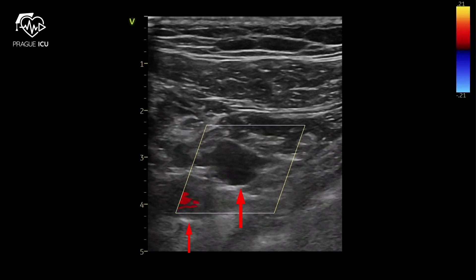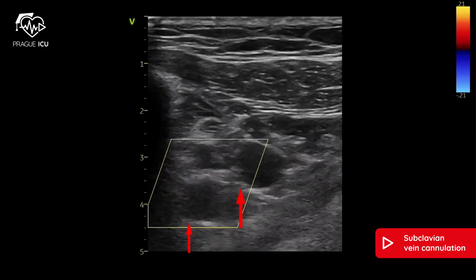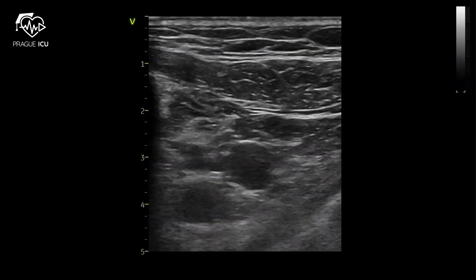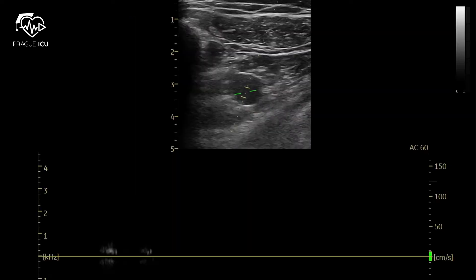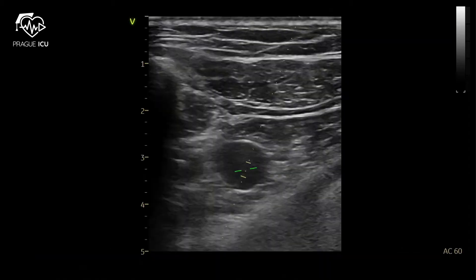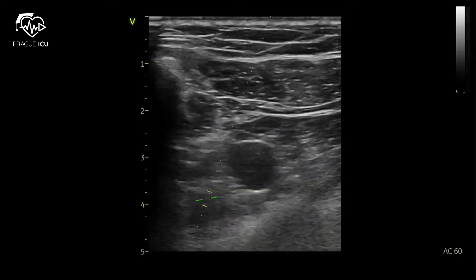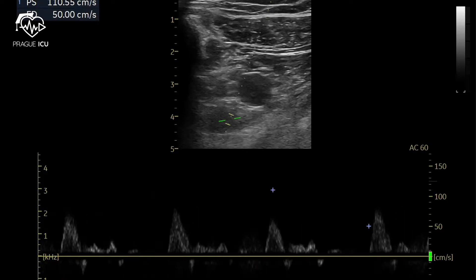The subclavian vein is oval-shaped and collapses easily. The subclavian artery is round-shaped and doesn't collapse under compression. Also use color Doppler — pulse Doppler in the subclavian vein shows low amplitude waveforms, while the subclavian artery has high peak pulsatile waveforms.